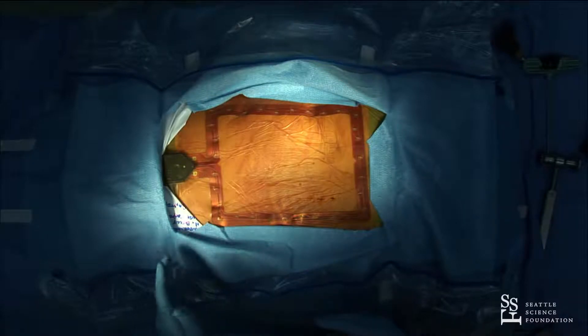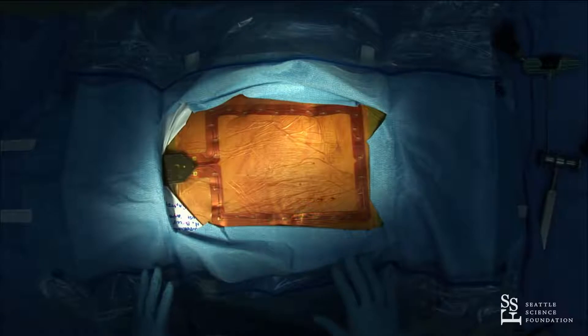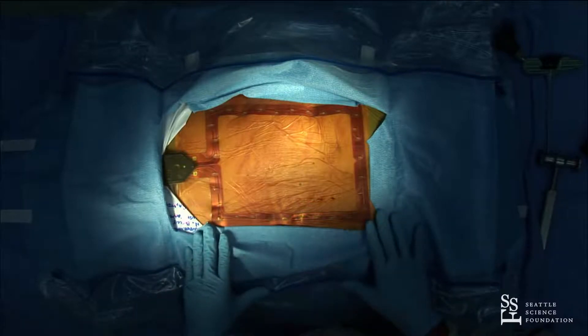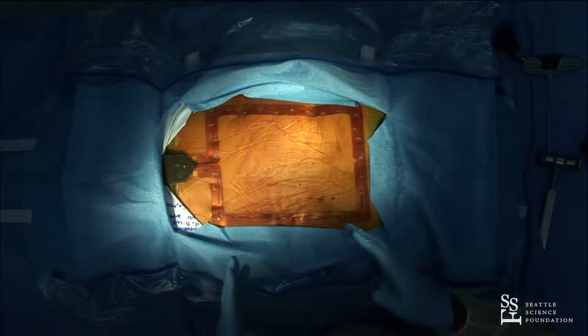What the spine mask does is replace the need to put pins in the pelvis or a bony fixed marker. My setup in the OR is that we prep and drape the patient, put the mask on, do a CT spin with the Ziem, and then we're at the point where we currently are.